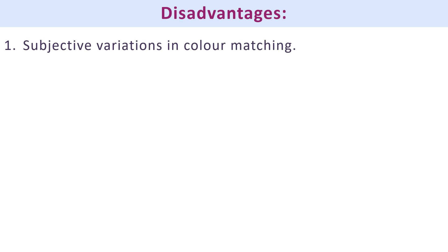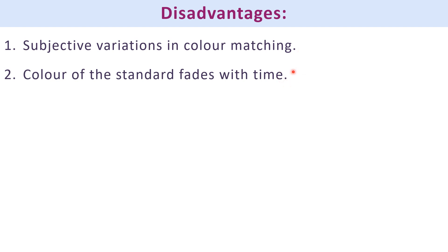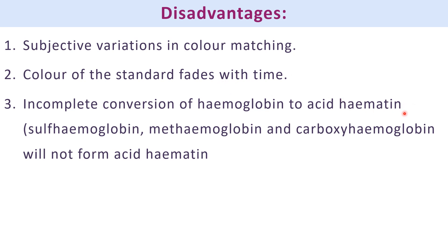Disadvantages: first, there can be subjective variations in color matching. Second, the color of the standard can fade with time, affecting accuracy. Third, there can be incomplete conversion of hemoglobin to acid hematin — for example, derivatives like sulfhemoglobin, methemoglobin, or carboxyhemoglobin will not be converted to acid hematin.